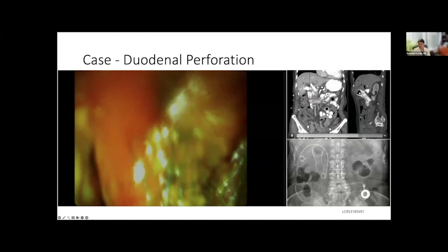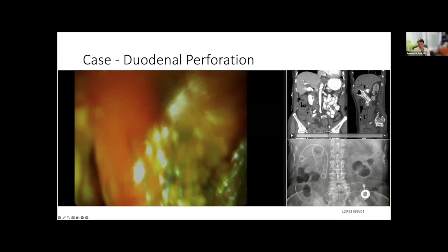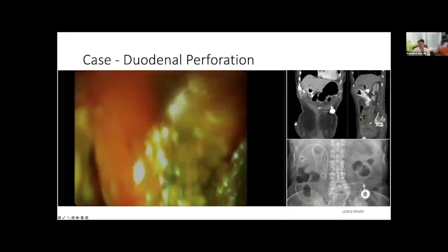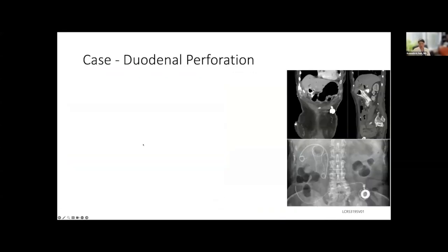And it's digging right into the liver, which you saw on the endoscope. And so this is the danger of placing a high axial force stent in an angled area, because the stent is trying to do its thing to straighten out, but guess what happens? It can perforate.